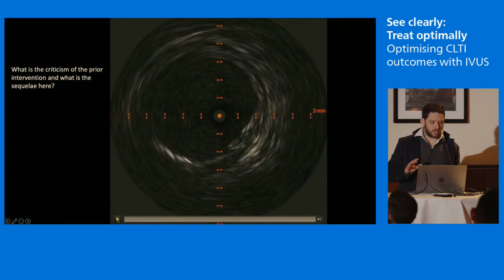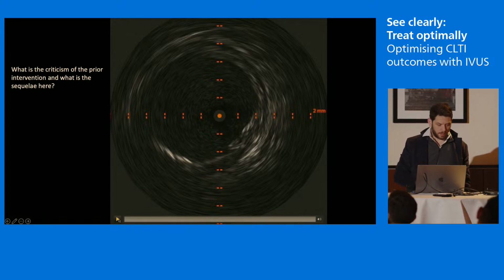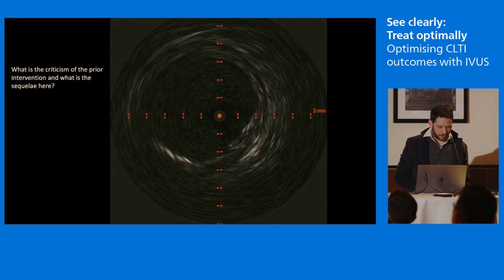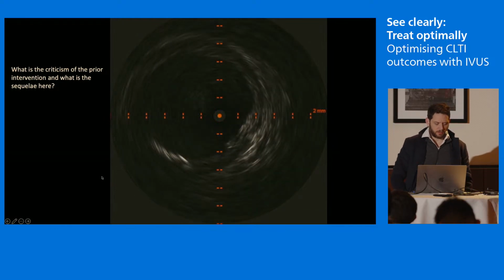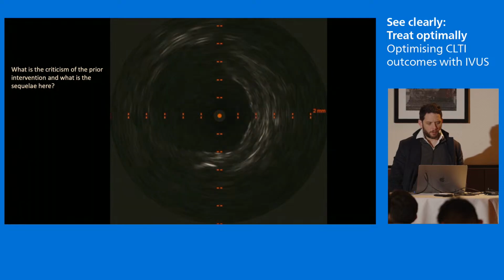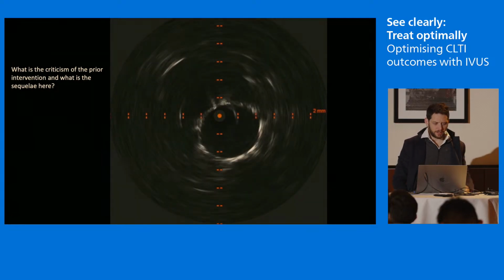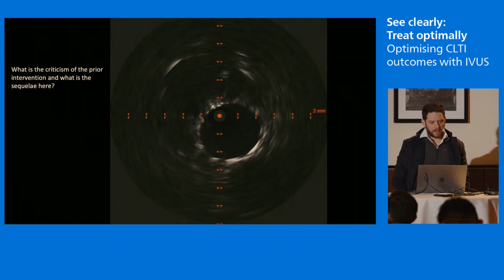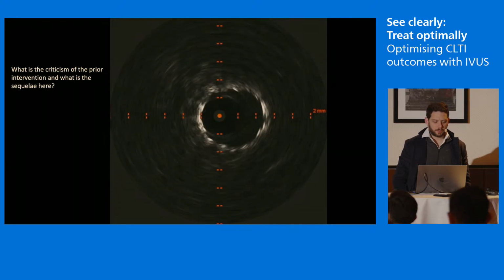So this was a patient treated as an emergency in another country, not Germany or England, or actually anywhere for anyone in this room. They were treated empirically for thrombosis of the common iliac artery. So I've used the 18 IVUS here, and I've done a pullback, and we are in a stent there. That's a stent graft.